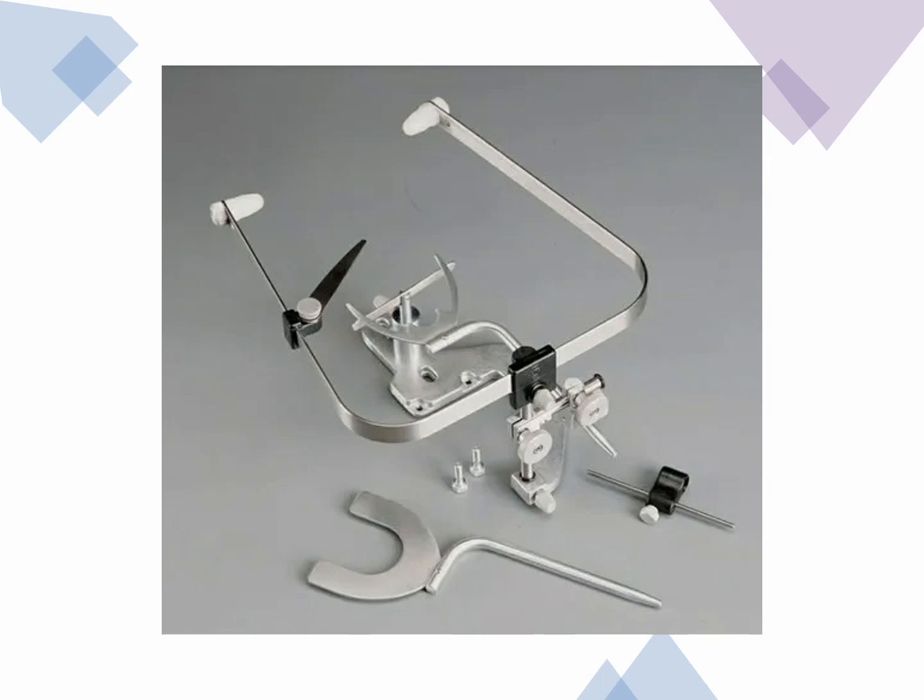And this is the U-shaped frame which extends from one side of the face on the outside to the other side, and this is the bite fork, or this is the stem, and this bite fork has to be seated or inserted into the occlusal rims and placed intraorally for recording the orientation jaw relation. And then we have the transfer jig assembly, which is used for transferring to the articulator.